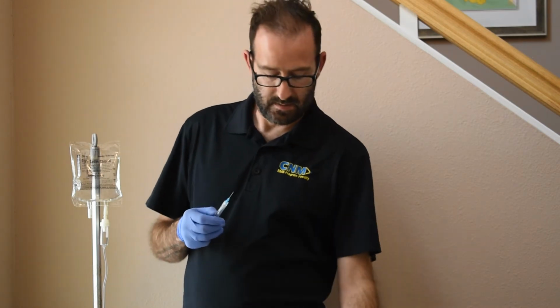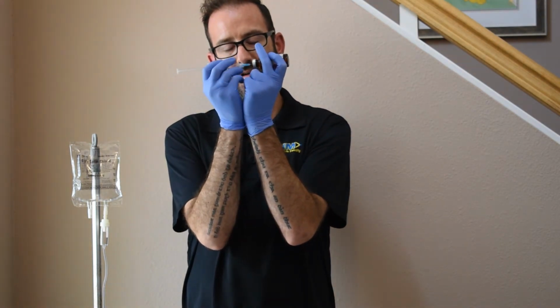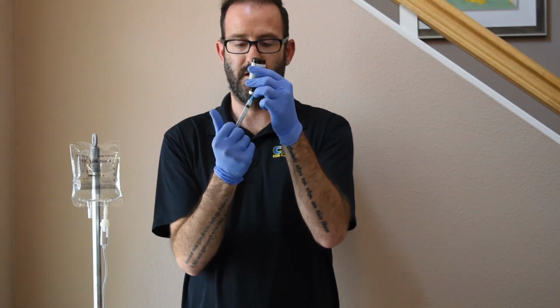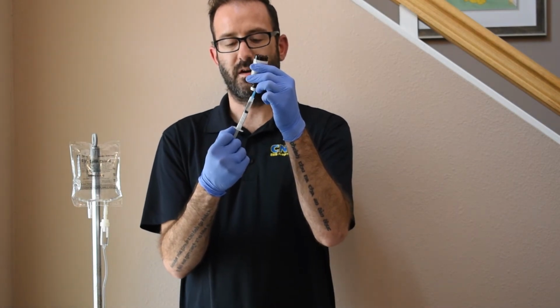I'm going to take my cap off using my 2-hand technique so that I'm steady. I'm going to insert into the vial, push my air in. It's going to start pre-filling my syringe for me. I don't want to go too fast.